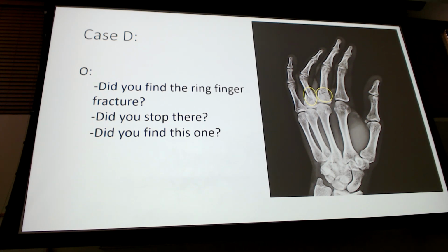If I didn't tell you in the vignette that there was pain in the long and ring finger, would you have found it? This is a question for yourself, right? If I didn't tell you that, would you have found it? And at this point, I think with most of you, the answer is yes, I would have if you didn't stop at the shiny toy, right?